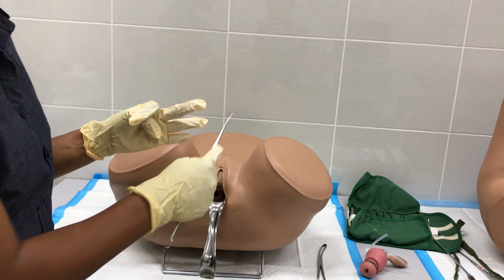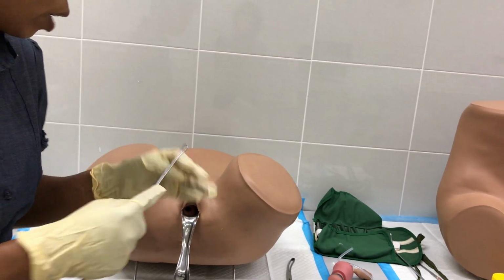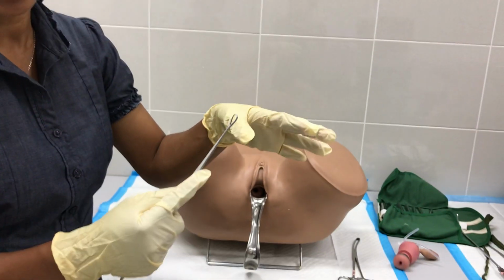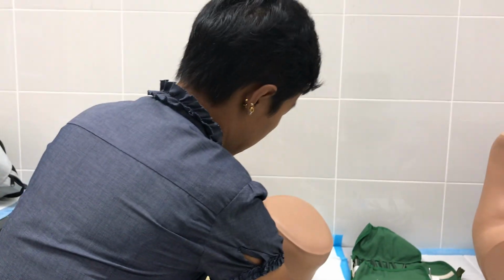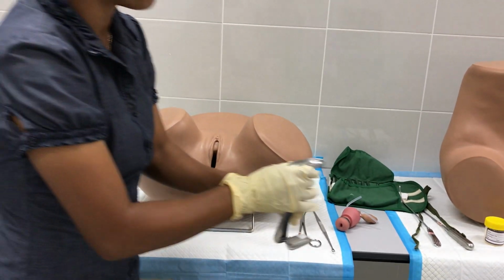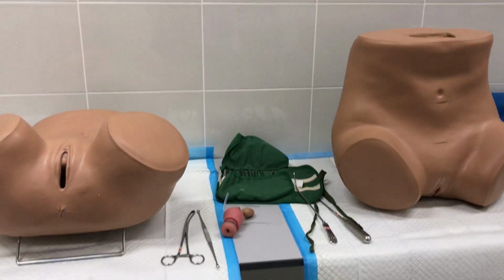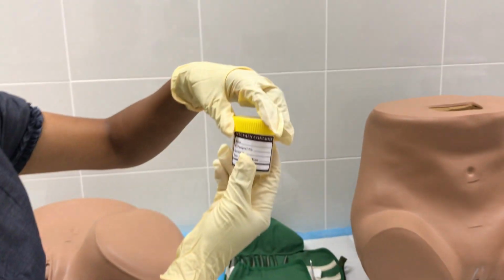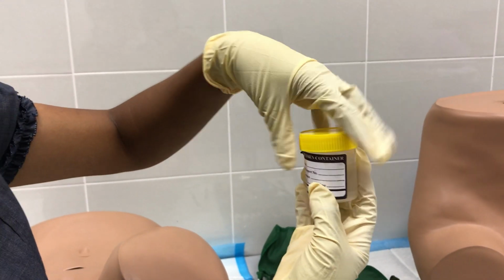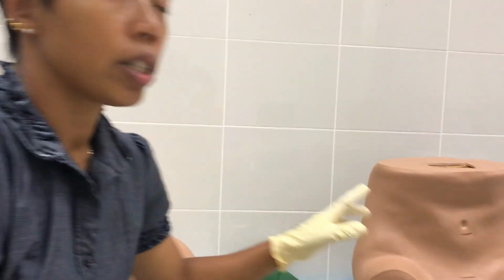Another one is less bleeding. Compared to the initial procedure, it's less bleeding. If you see all these signs, you stop the procedure. That means that your POC is already finished. Then after that, you take all the tissue from the speculum, then you put it into the specimen bottle. This is the specimen bottle. So you place the patient name, IC number, the diagnosis, everything, and then you put it inside. Then you close it and you send it for histopathological examination.